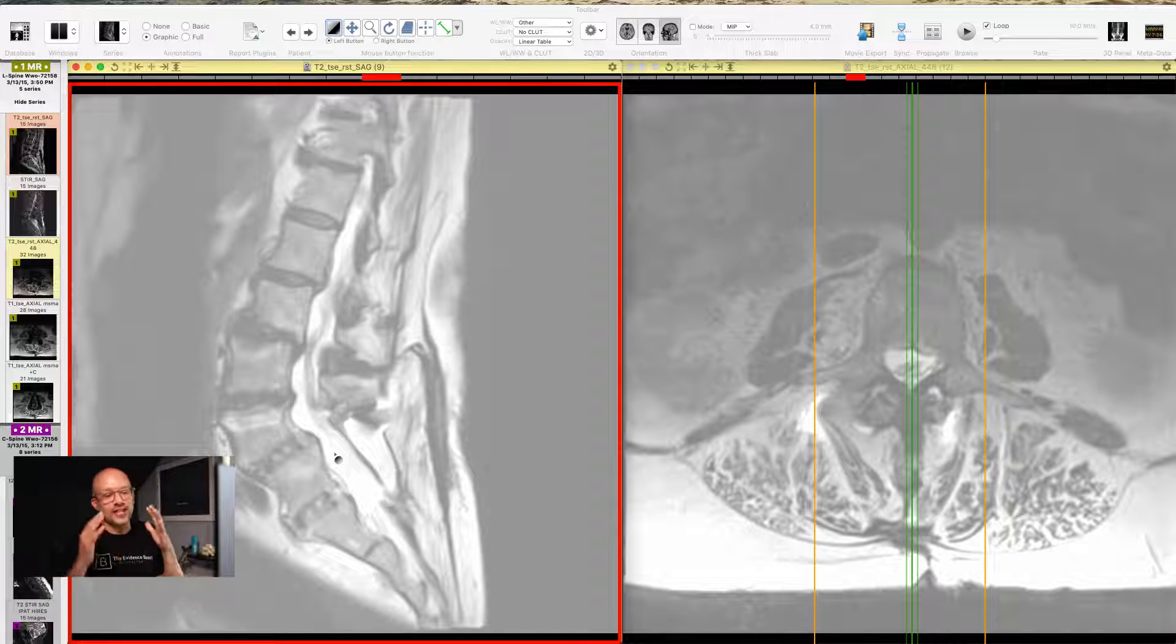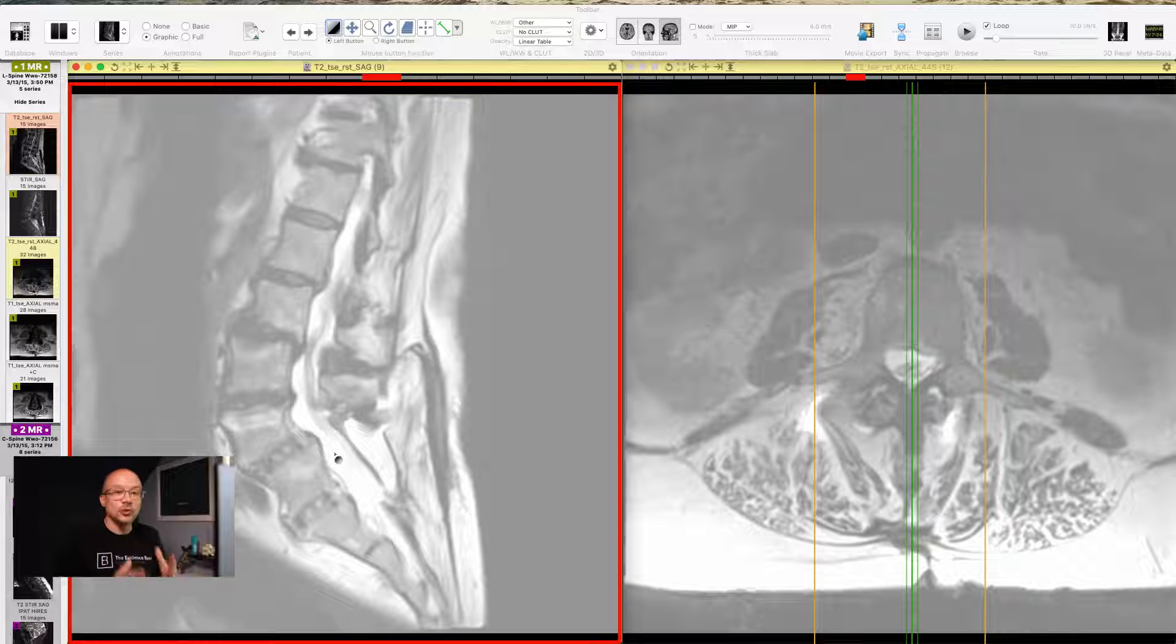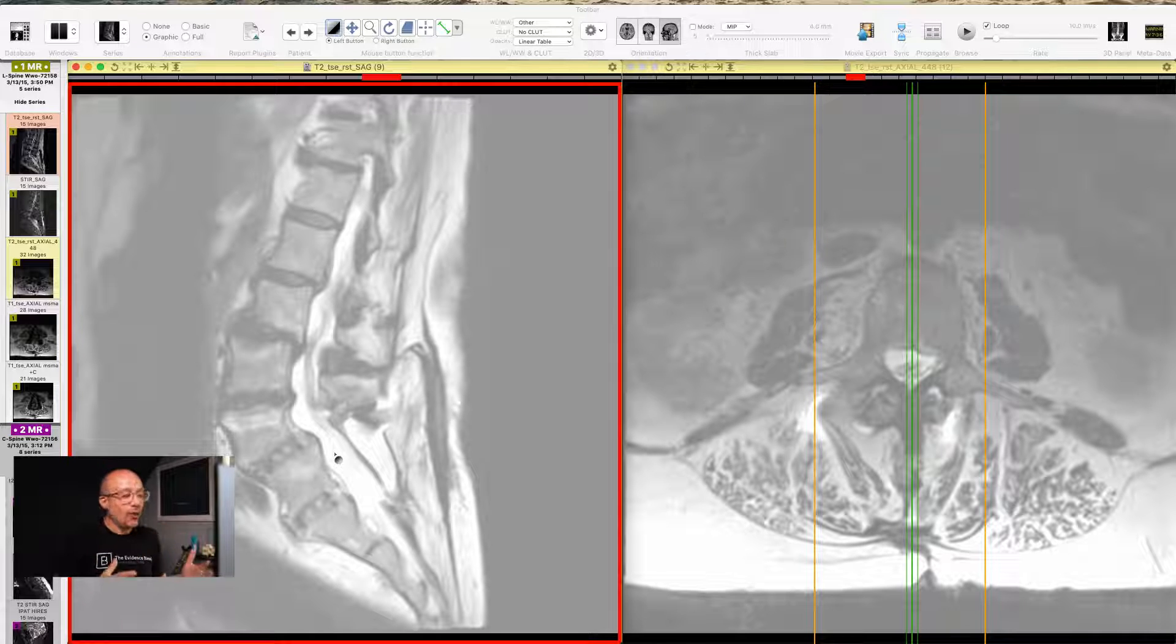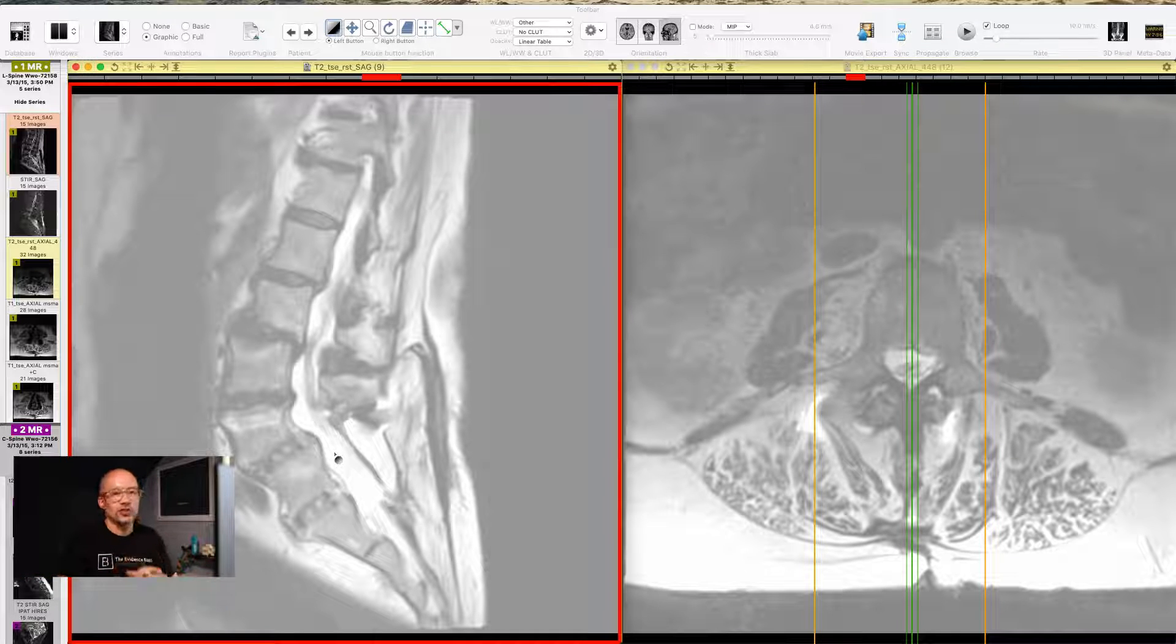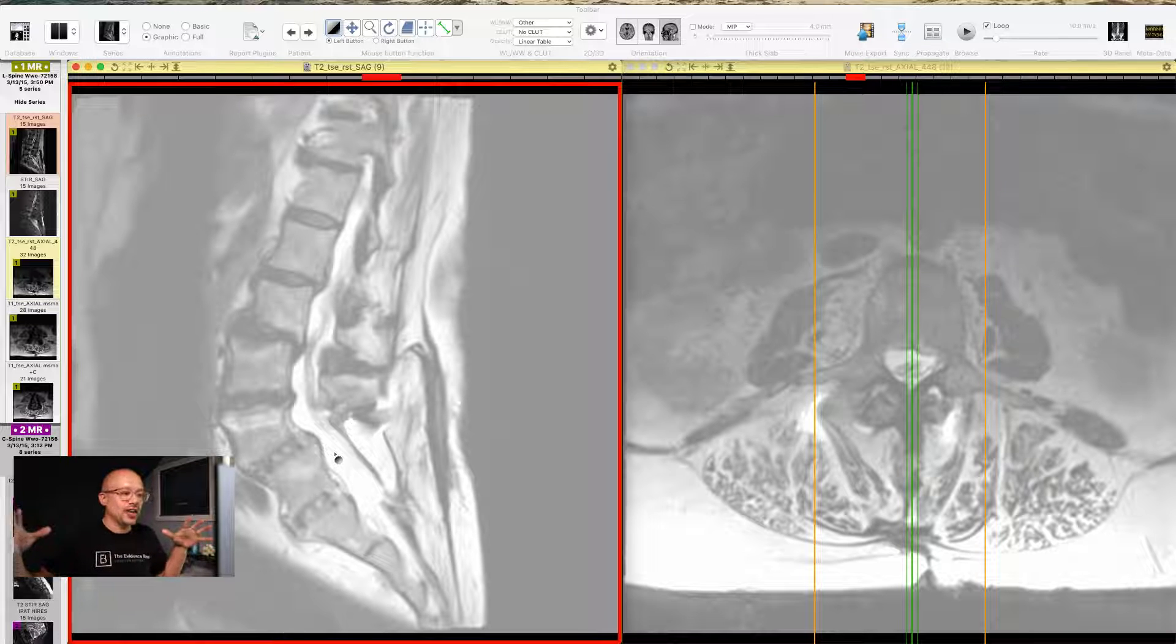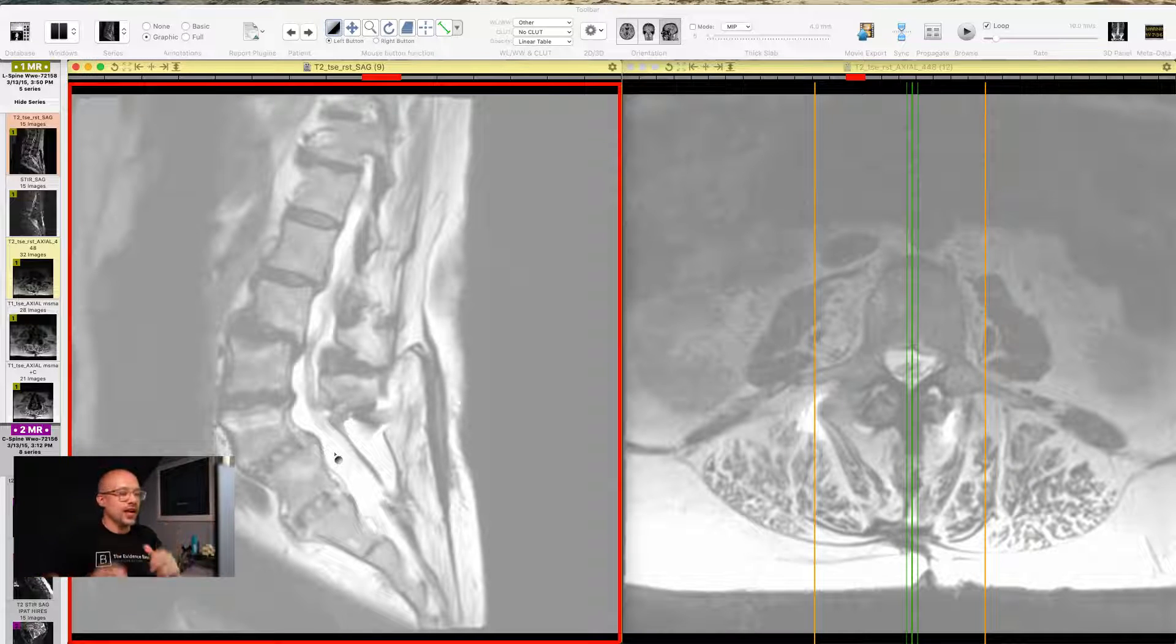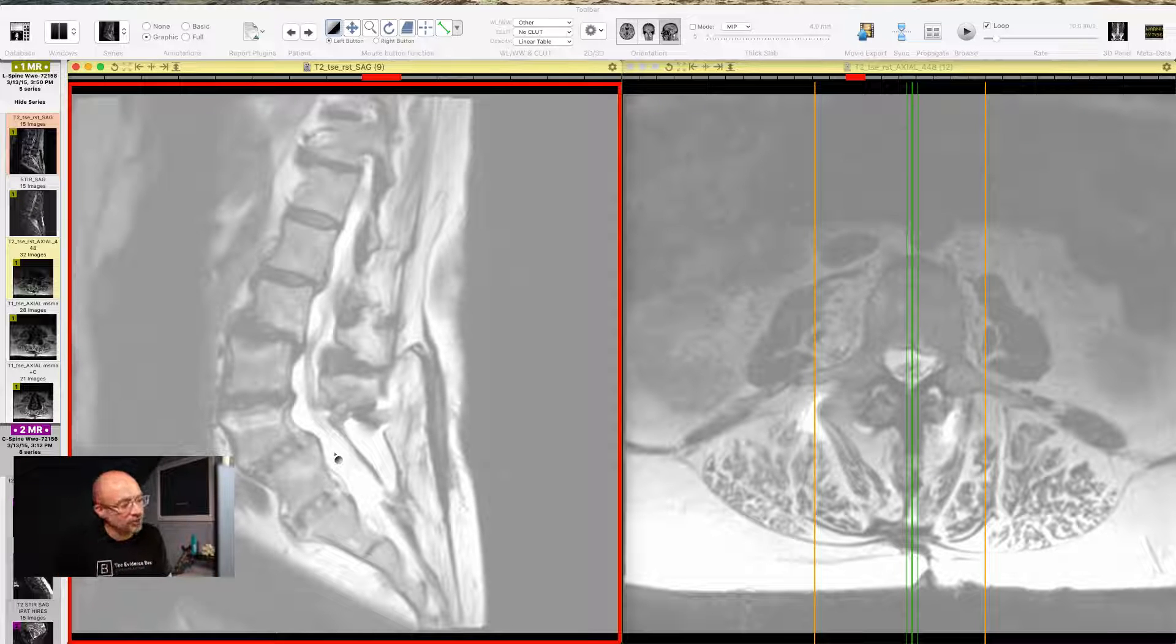So that is a fluid collection that has happened as a result of the surgery. Now in almost every single lumbar or cervical spine fusion, there is fluid that gets collected in the area. However, that fluid is expected to dissipate throughout time. So nearly every single surgery has a fluid collection right afterward, but that should dissipate throughout time unless it becomes encapsulated, at which point we call it a seroma, and that means it is not going anywhere.